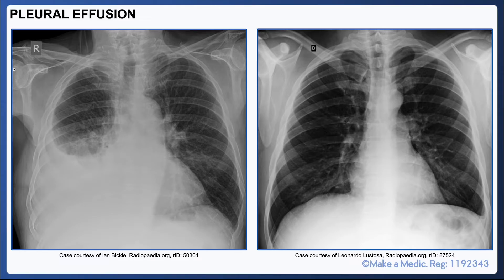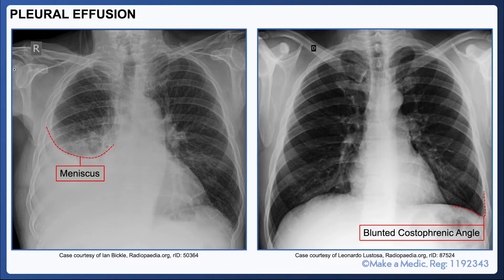Pleural effusions can be pretty obvious if they're large — on the left hand image we can see a clear meniscus — but smaller pleural effusions are much less obvious, which is why it is important to inspect the costophrenic angles. The image on the right at first glance looks relatively normal, but in fact the left costophrenic angle is blunted. It's worth bearing in mind that it takes quite a bit of fluid, around 200 mls or so, for a pleural effusion to actually be visible on the chest X-ray.